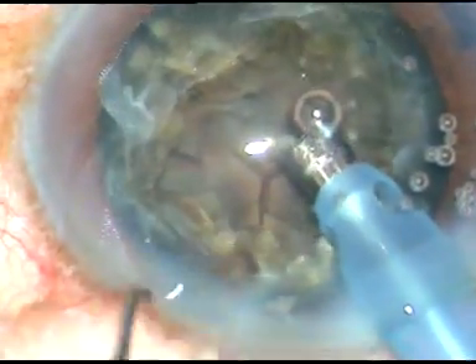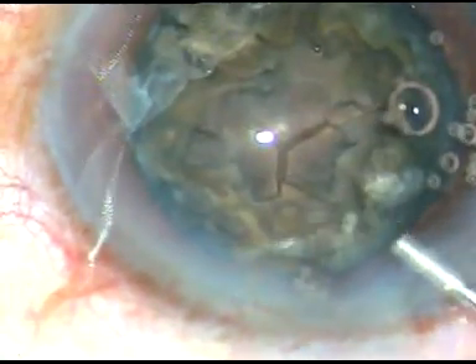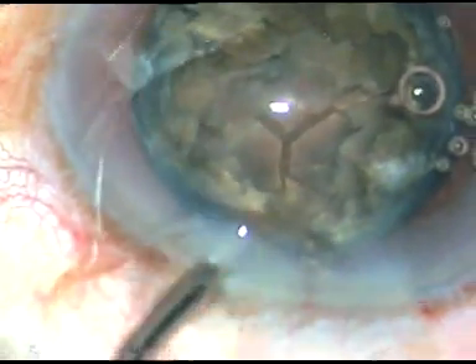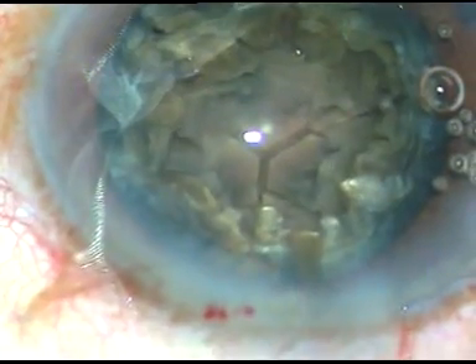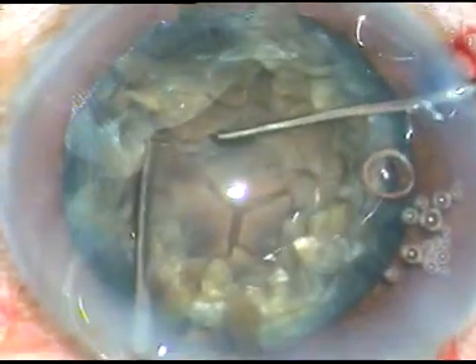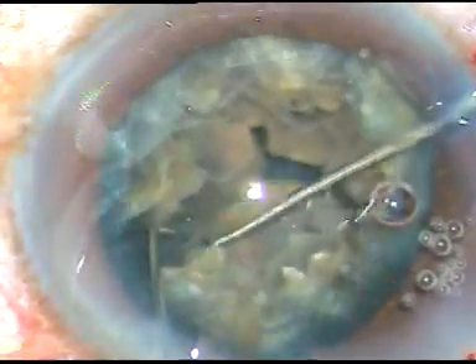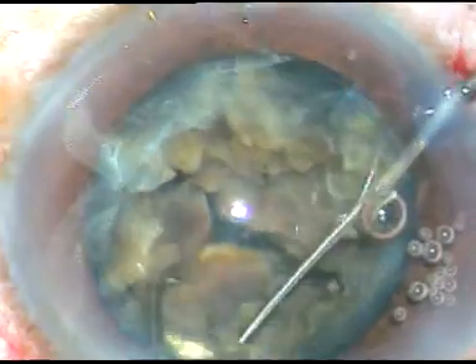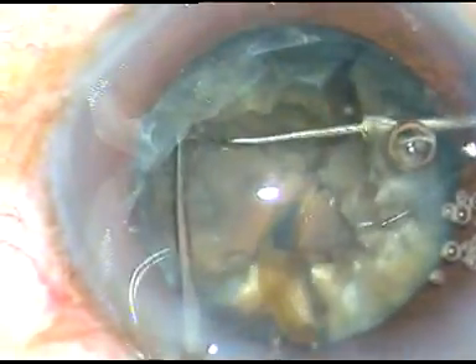So what I do is I come out, inject some more viscoelastic substance — HPMC. And then I take two instruments: a chopper and a Sinski hook. The chopper is in my left hand. Yes, here I can see that the nucleus is divided into two halves. This semi-nucleus has been separated but this semi-nucleus could not be separated — the two pieces are still joined centrally.